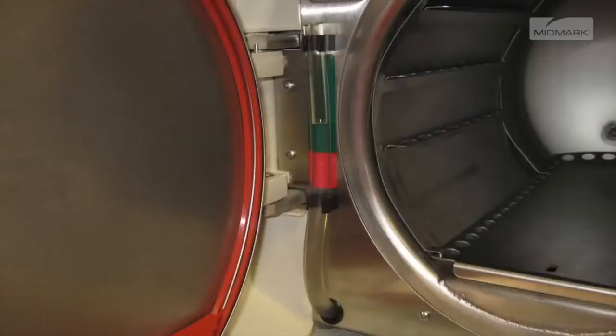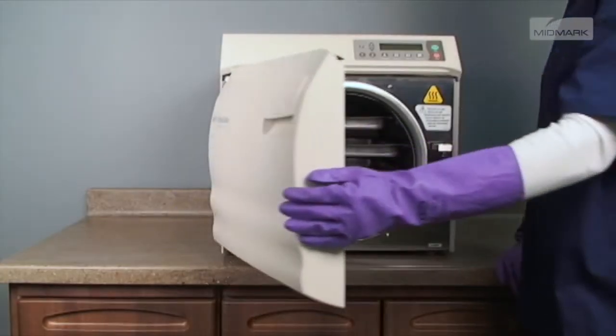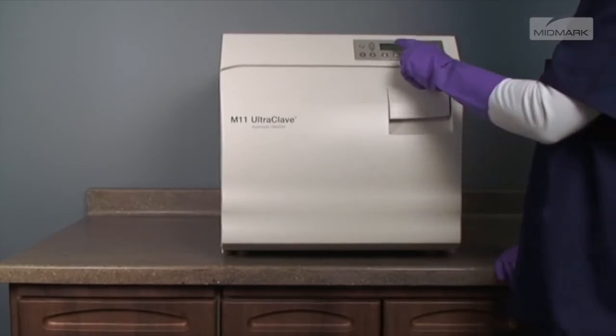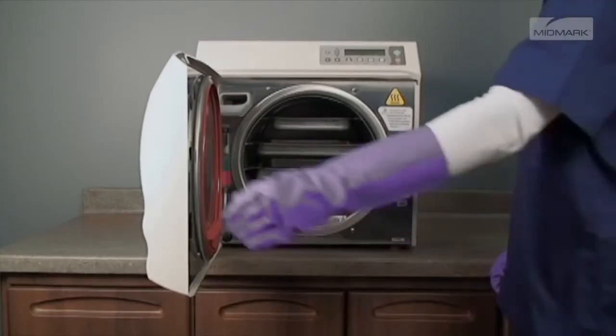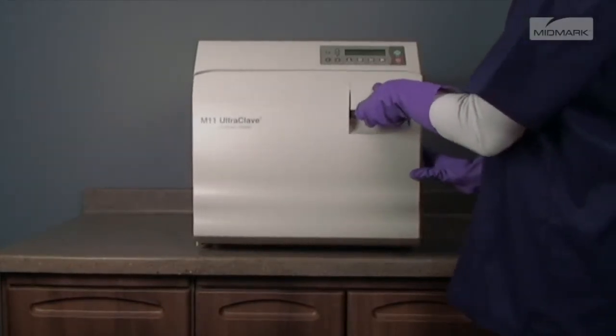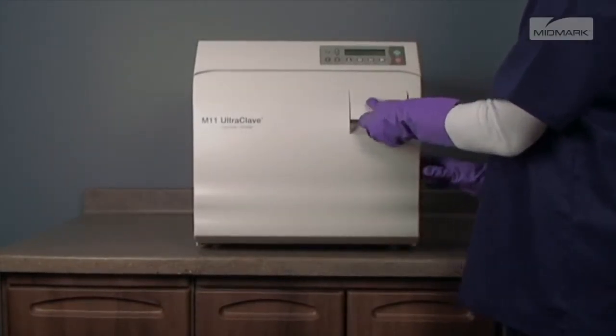After verifying that the autoclave has an adequate fill of water and has been loaded properly with sterilization items, close and latch the door. This is done by lifting the door handle and pushing the door closed. While pushing in on the door, slide the door handle down to engage the latch.